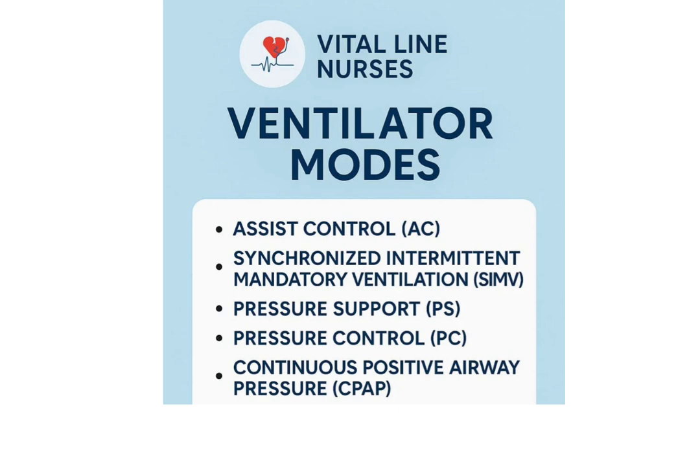Now that we've covered the ventilator settings, let's move on to something just as important, the ventilator modes. Modes tell us how the ventilator is supporting the patient's breathing, whether it's doing all the work or just helping out. Have you heard of CMV or SIMV before?